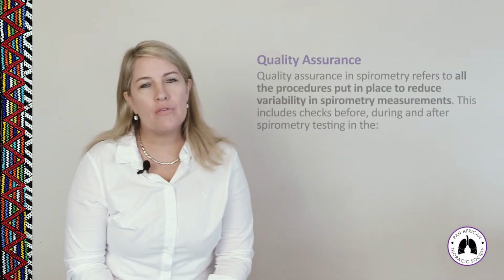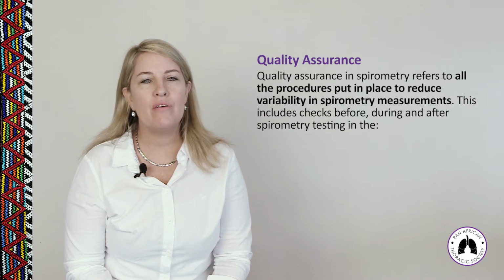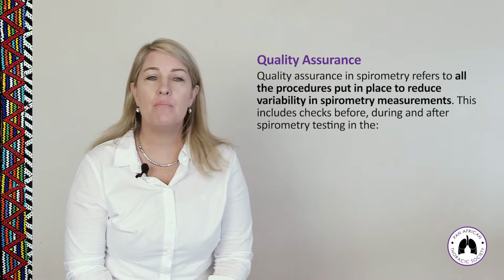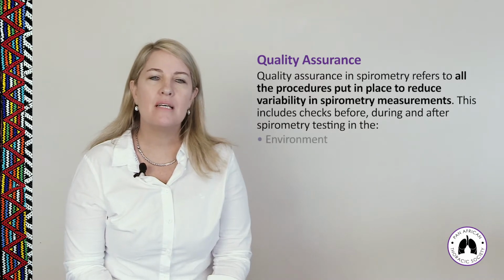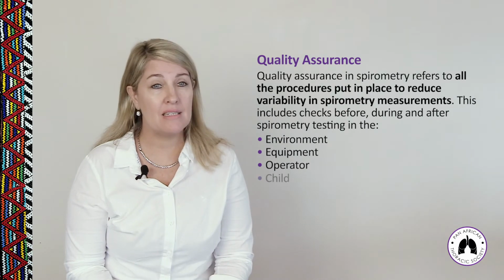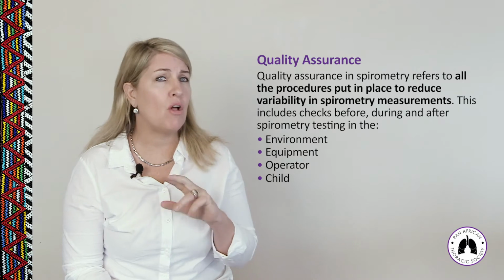So, quality assurance in spirometry refers to all the procedures put in place to reduce variability in spirometry measurements. This includes checks before, during, and after spirometry testing in the environment, with the equipment, with the technician, and with the child. So just to be very clear, there are two different terms that people often confuse.